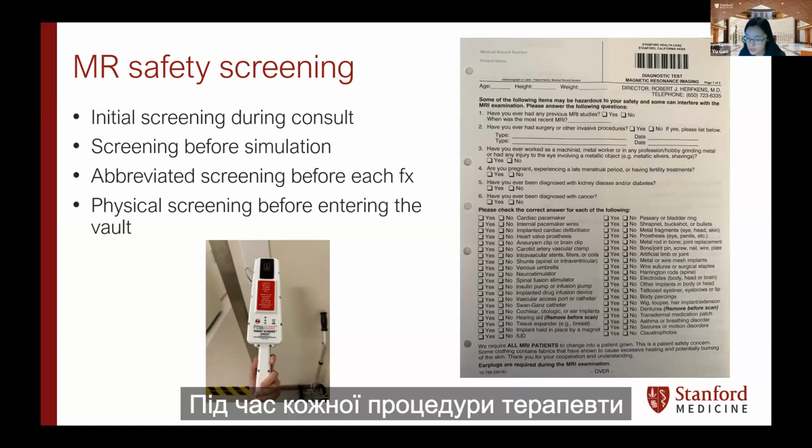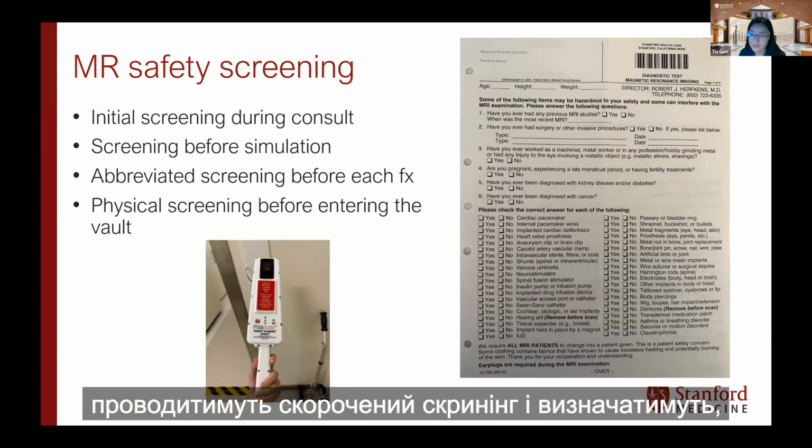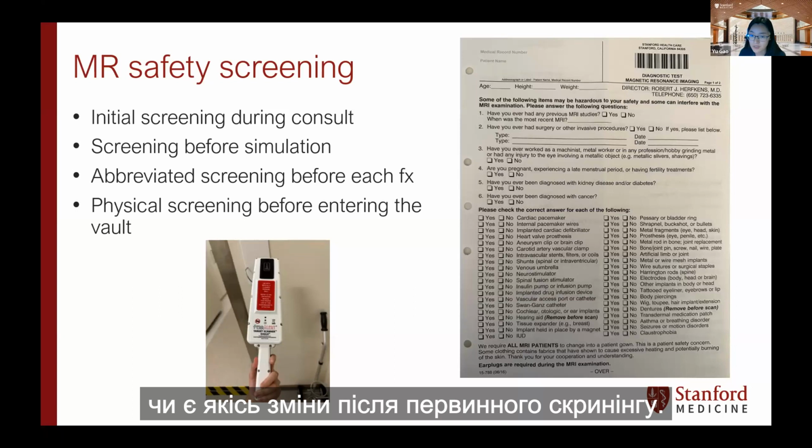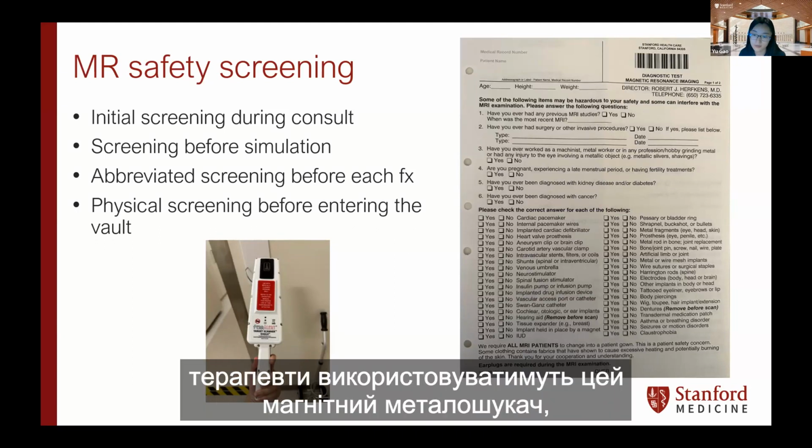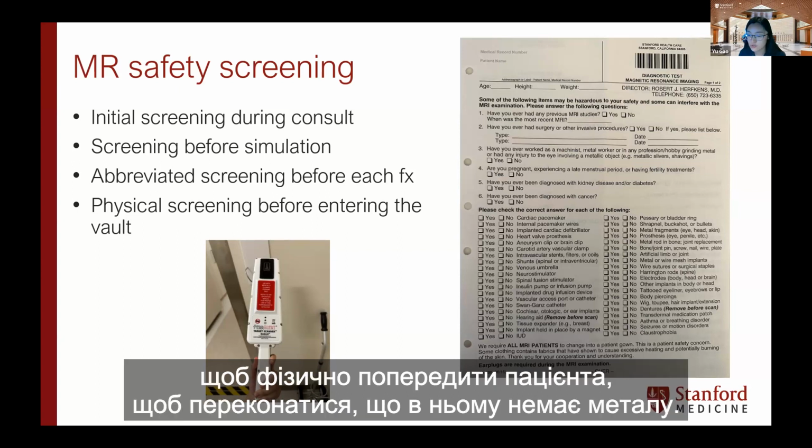During each treatment, therapists will conduct an abbreviated screening and identify whether there's any change after the initial screening. And lastly, each time before the patient enters the vault, therapists will use a metal detector to physically wand the patient to make sure there's no metal on the patient.